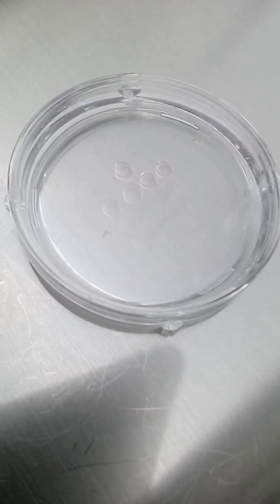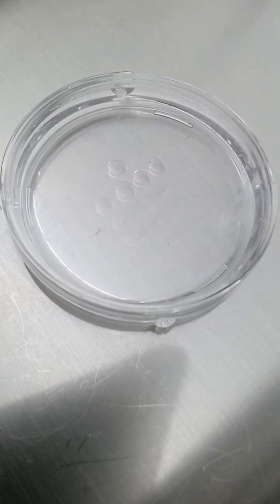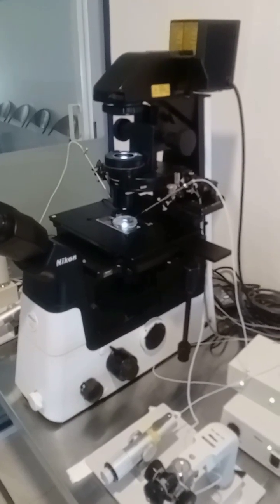Following denudation, I make an ICSI dish with 2 streaks of PVP and few drops of GMOPS. I load the sperms in the PVP and start with immobilization and ICSI. And once the ICSI is done, I transfer the oocytes into the post ICSI dish and wait for them to fertilize. And that is the end of an OPU.